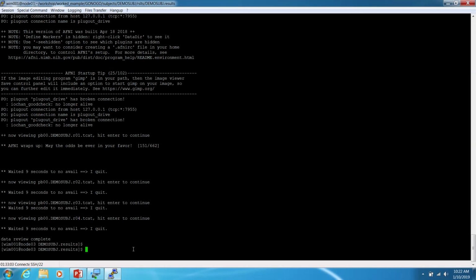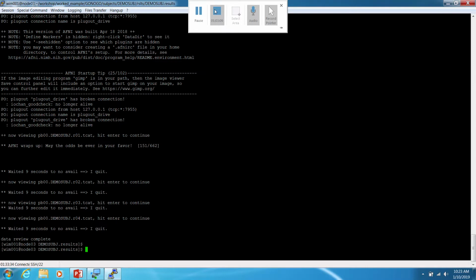Unfortunately, the motion that tends to get outliers and things like that occurring in their data where we drop volumes is usually due to that kind of back and forth wiggle movement. So that's part of why you'll notice so much of the QC review centers on motion. That's because it's really central to ensuring we have good data. Okay, so that's what I wanted to cover in this workshop.